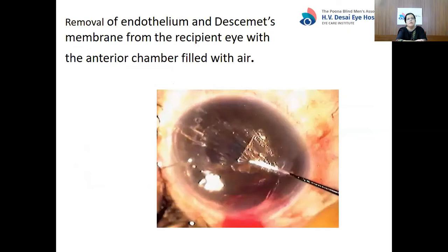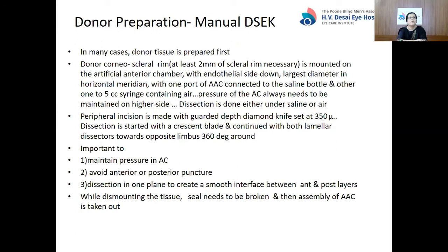This is a photograph showing the scoring of Descemet's membrane. Coming to donor preparation — in many cases the donor tissue is prepared first, especially for clean cases like pseudophakic corneal edema or Fuchs' dystrophy. The donor tissue is prepared first so that once the patient is on the table, that much time is saved. On the other hand, if there is a case of PBK with anterior surface scarring or vascularization, or cases where you are not sure that the Descemetorhexis will be possible, then the recipient bed is prepared first and the donor prepared later.